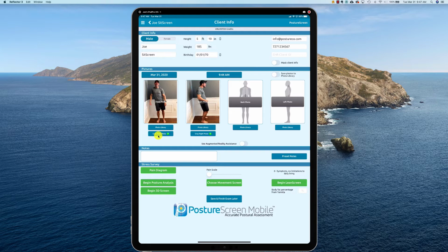Remember, augmented reality, the benefits of that, if this was in the office, you could do this real time. The computer is going to find the spots for you, and literally you do a posture assessment in like 3 to 5 seconds. Literally, it takes no time to do it, and then you just double check the work. If you have no idea what I'm talking about, either email in or do a search in our knowledge base for augmented reality. It's the new assisted posture methods on the newer iOS devices, which is truly amazing.